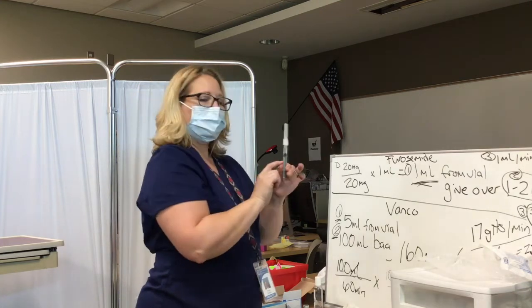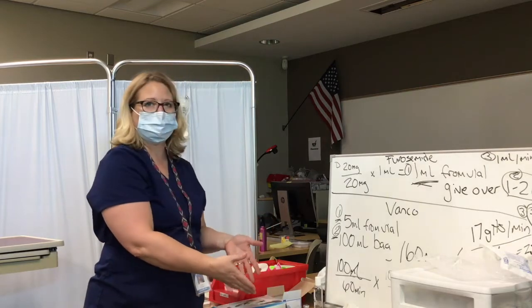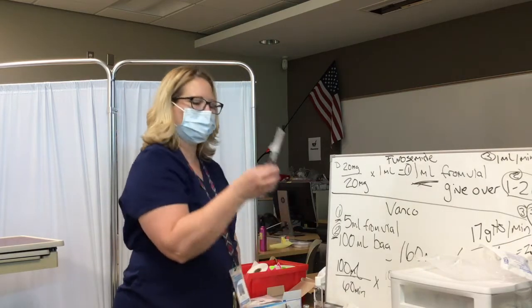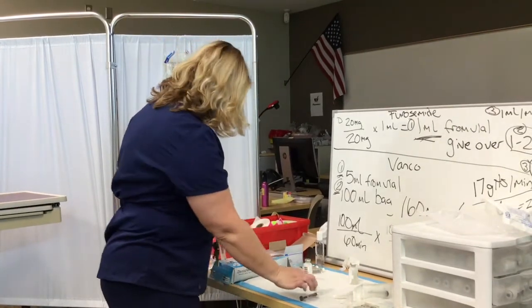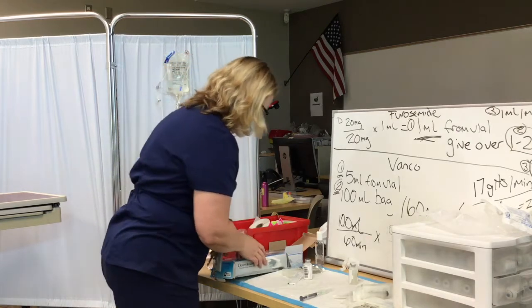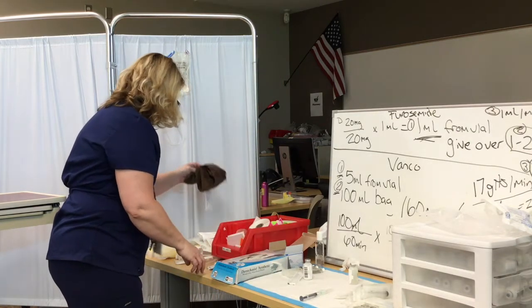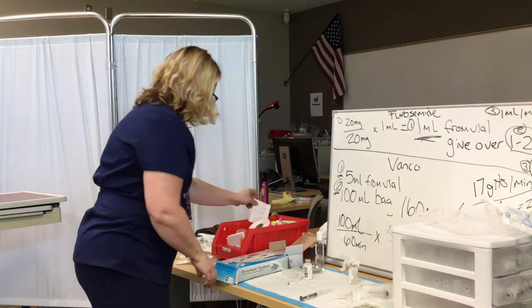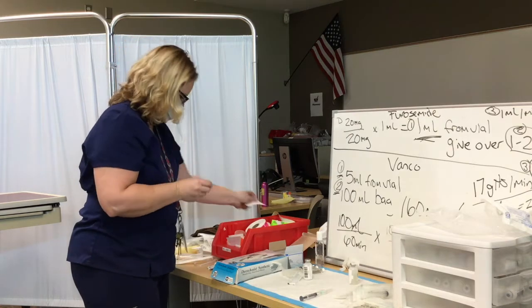All right. Now, I'm not going to drop this on there because this needs to be labeled. This is medication. I don't want anybody mistaking this for saline or anything that it is not. So at this point, I'm going to write my labels. Where did I put my labels? I had them. Did they end up back in the bin? I had all my address labels. Well, I'm going to take this.